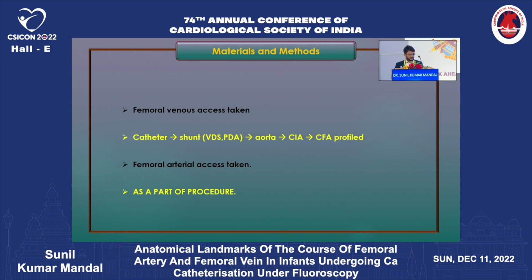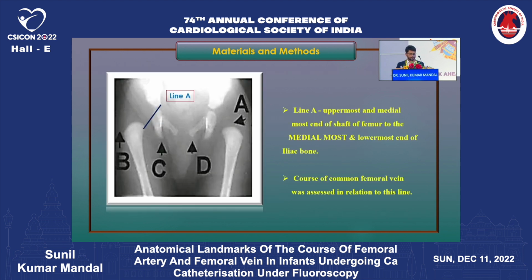Then the arterial puncture or access was taken. One thing should be emphasized: we didn't recruit infants especially for this procedure. We did this analysis in all those patients in whom we were already doing the procedure. So, no specific recruitment.